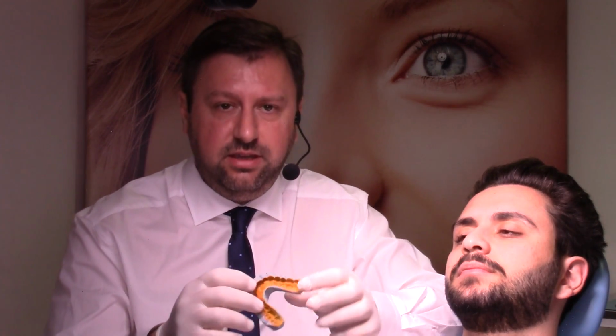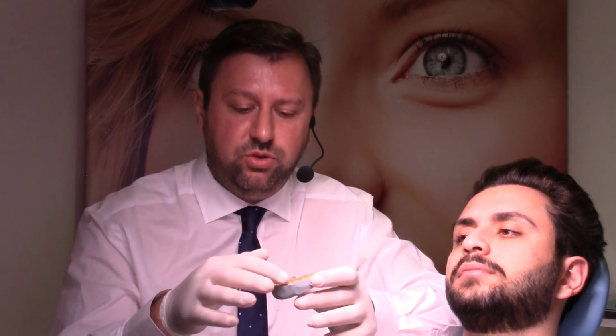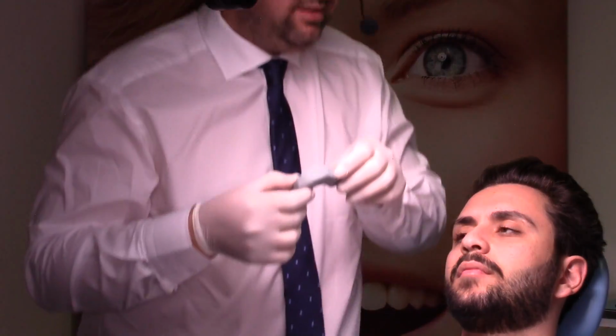And you took the impression on the model with heavy and light. Yes, heavy and light, to be much more precise. And you do all these arcades just to remove the excess of the material after. Yes, exactly. To have a beautiful zenith of the teeth. Okay, good luck. Okay, thank you.